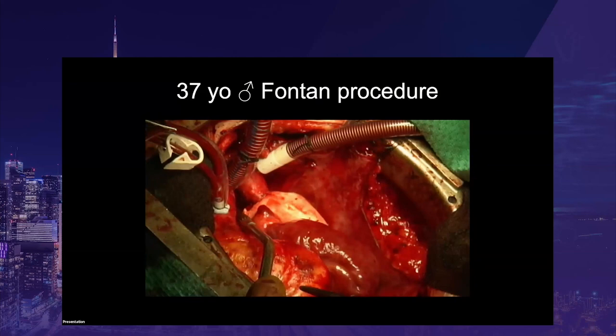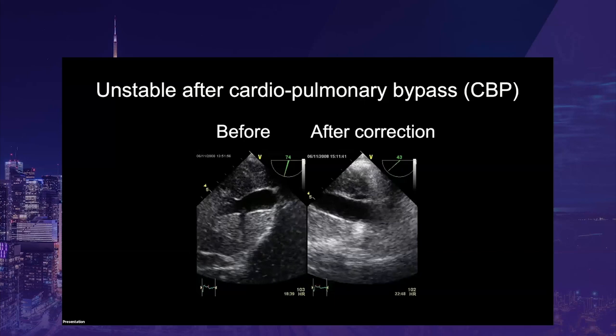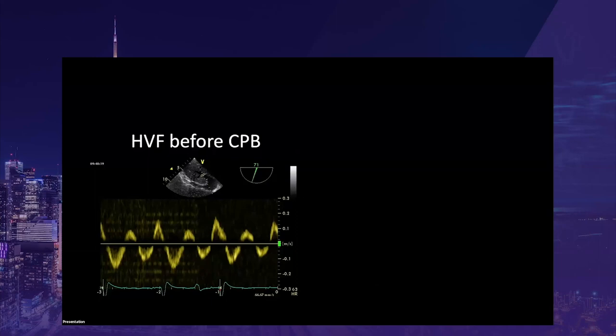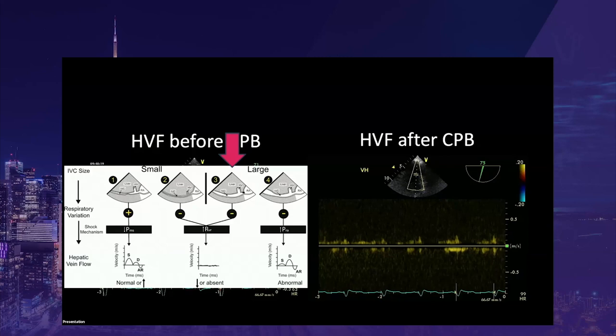Here is a 37-year-old man who had a Fontan procedure for congenital heart disease. He became unstable after weaning from cardiopulmonary bypass. A pulse-wave Doppler of the hepatic vein was mostly normal before cardiopulmonary bypass, but velocities were greatly reduced after. This finding, in combination with a dilated IVC, is compatible with IVC stenosis post-Fontan procedure. The possibility of IVC obstruction or stenosis should always be verified after any procedure involving manipulation of the IVC.